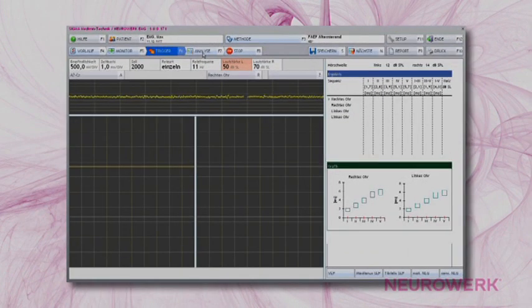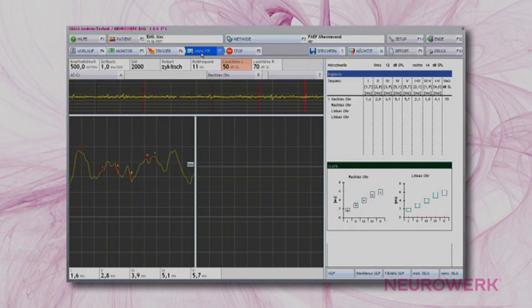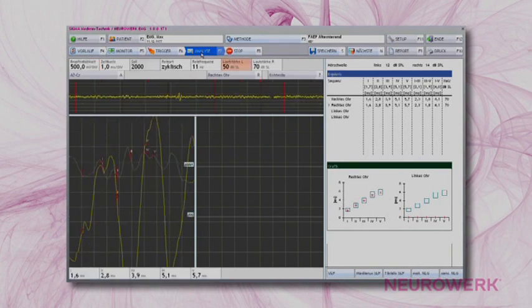The registration of the ABR starts with the analysis feature. For an applicable measurement, the potential is averaged 2000 times. If the potential size is displayed in characters that are either too small or too large on the monitor, the imaging sensitivity can be adjusted while measuring. Each measurement should yield the same result at least twice to ensure the reproducibility of the curve.